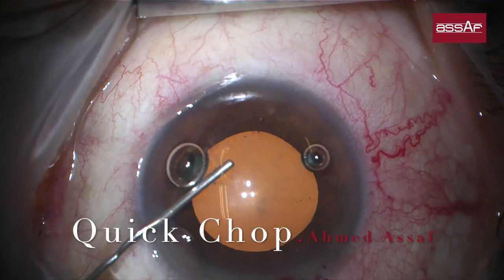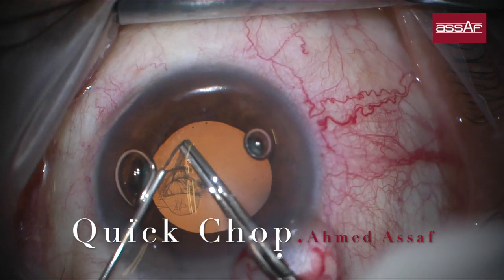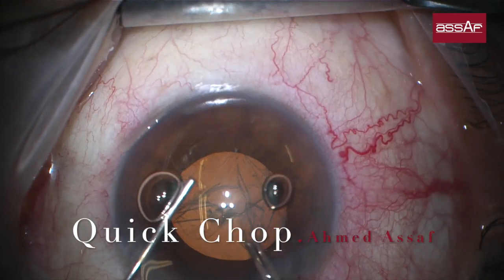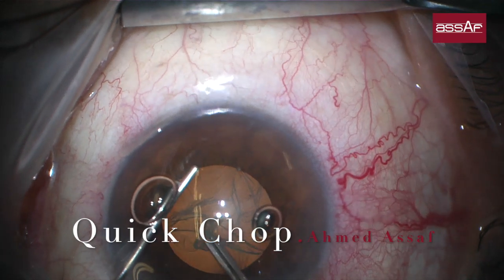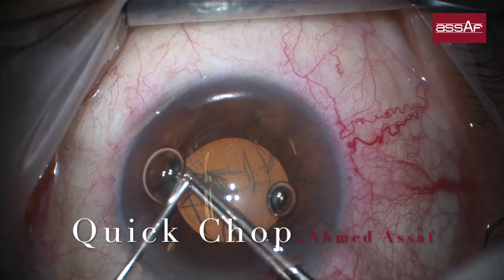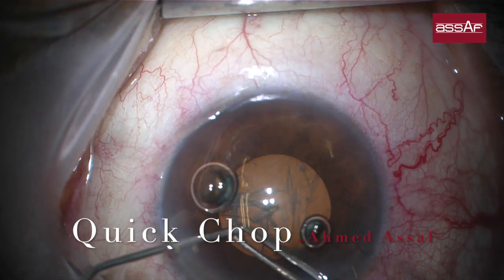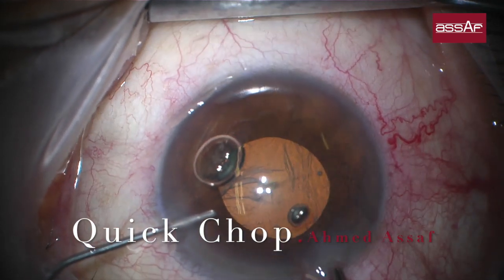By injection of viscoelastic inside the eye, we can mechanically dilate the pupil by stretching the iris tissue, and then proceed with rhexis formation in the usual way by following the edge of the pupillary border of the iris. It depends on the experience of the surgeon — if not comfortable with a mid-dilated pupil, use pupil expanders like iris hooks or the Malyugin ring. If confident, rhexis can be safely performed in these cases.